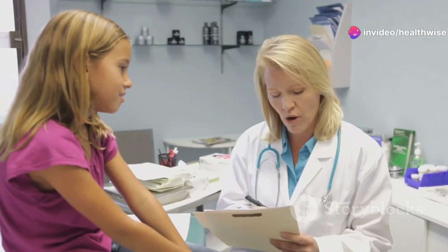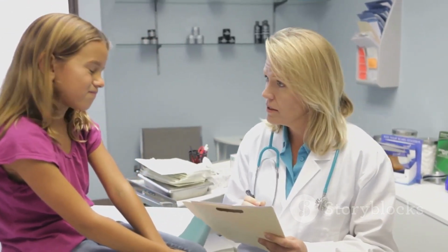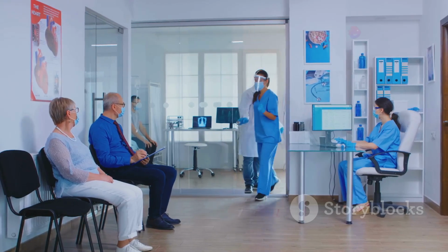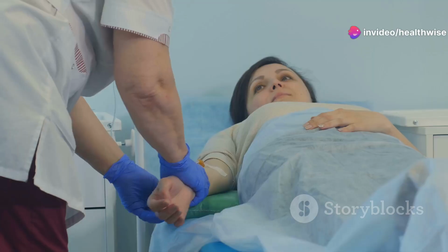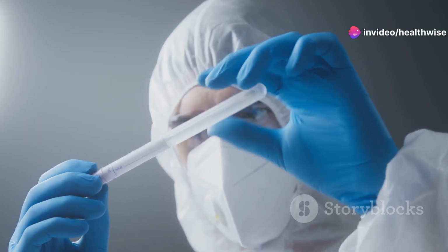After verifying, the patient receives a receipt detailing the tests and the expected delivery date for the lab report. Then, the patient is asked to wait in the designated waiting area until it's time for specimen collection. Now on to the collection of specimens. This process varies depending on the type of specimen required.